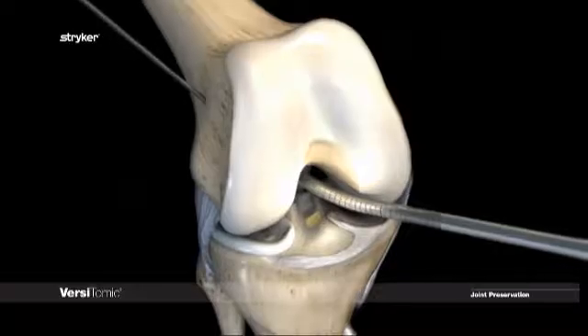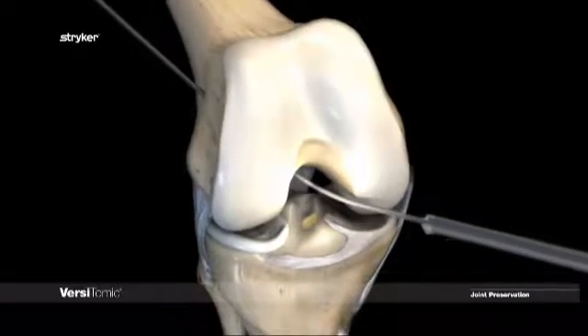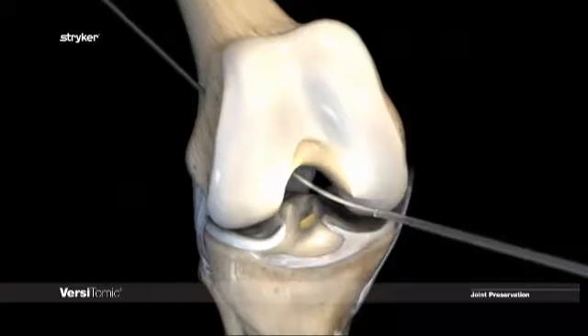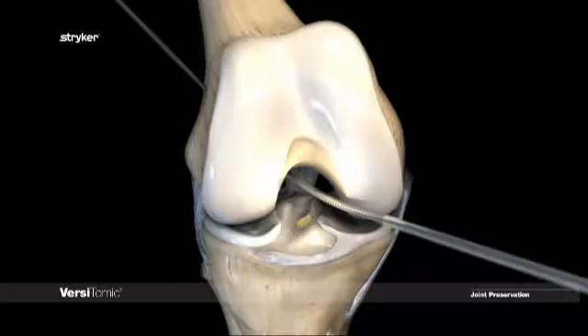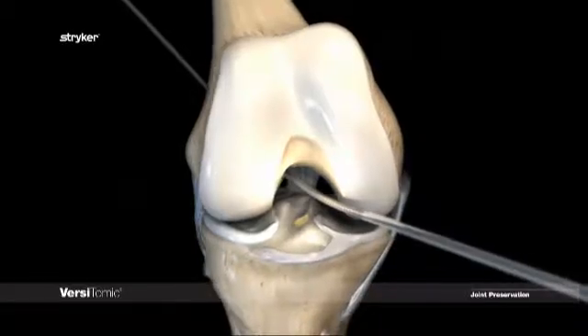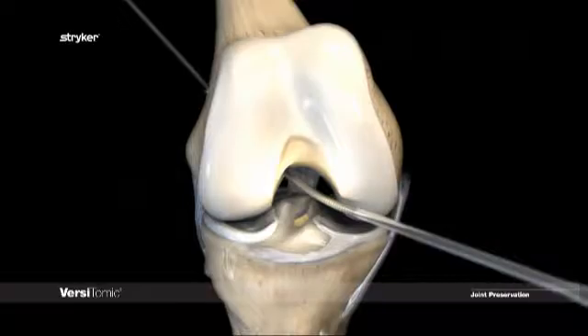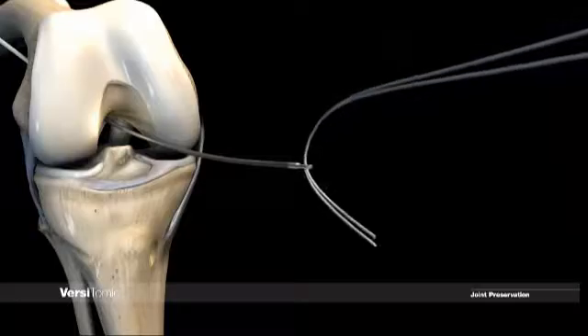To utilize the Versatomic G-Lock suspensory fixation, the tunnel must be reamed through the distal cortex with the 4.5 mm Versatomic flexible reamer. Do not use excessive force with the small shafted reamers, 4.5 to 6.5 mm — wait for the reamer to do the work. Once tunnel creation is complete, use the suture eyelet to pass suture through the femoral tunnel.